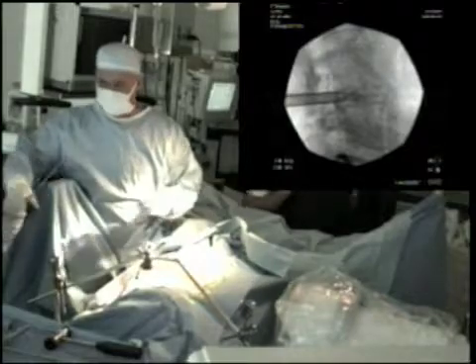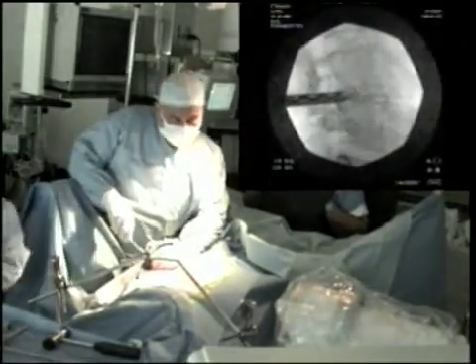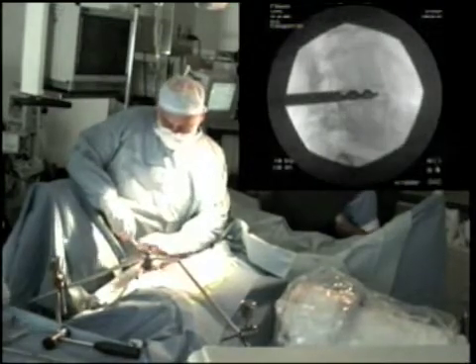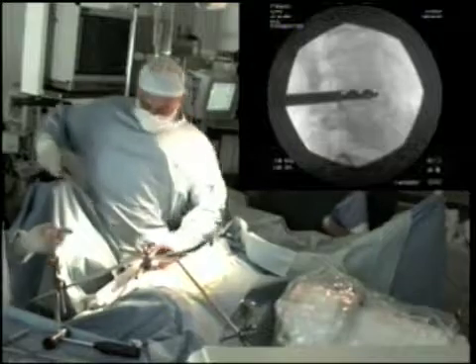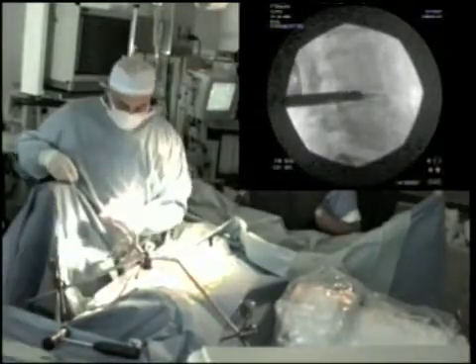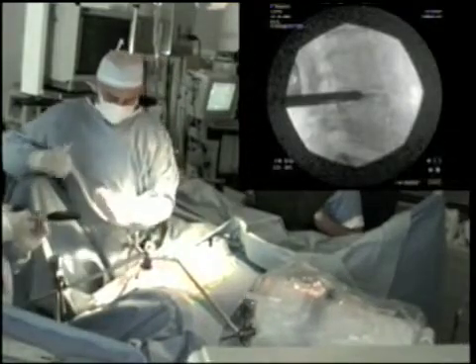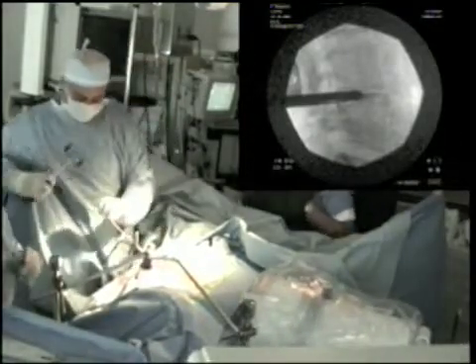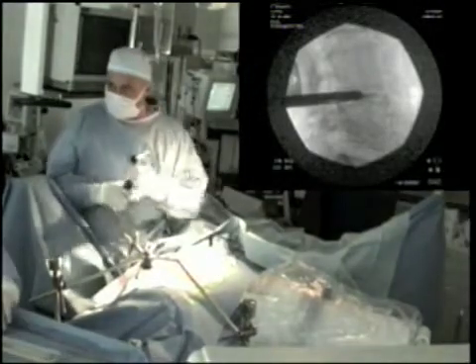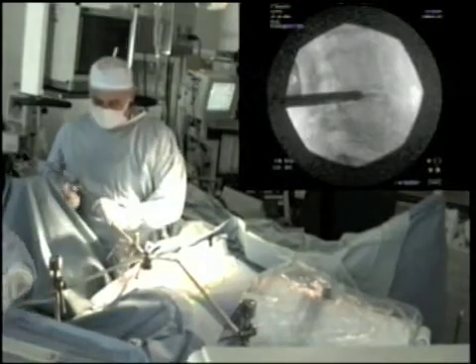The interbody cage is attached to a specialised driver and is inserted through the sheath under fluoroscopic guidance. Once the collapsed cage is in place, allograft bone is manually packed into the space.